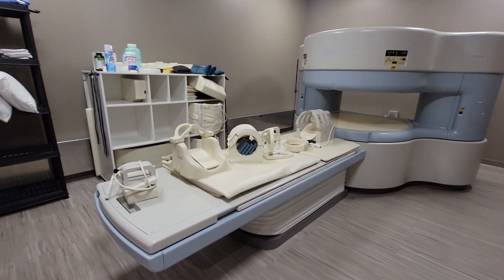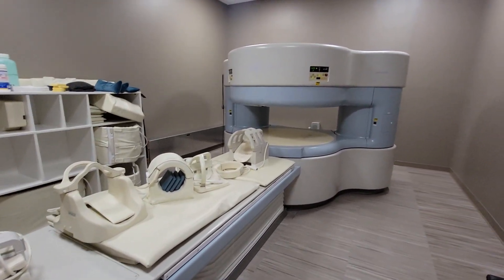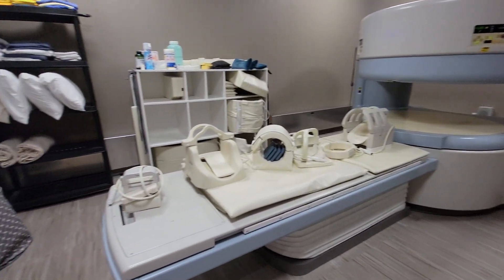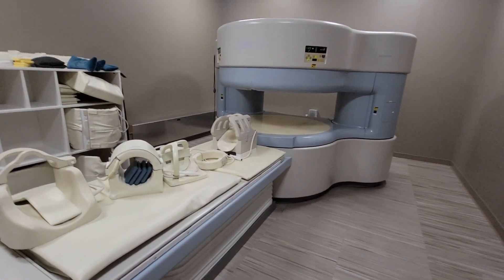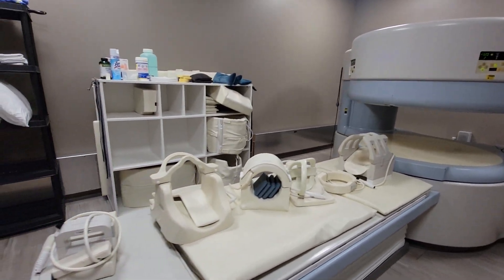Hey guys, my name is Roberto and I'm gonna do a quick overview of the Hitachi Ares Elite 0.3 Open MRI scanner. We're gonna review the coils and some of the tips I have for you if you're scanning on this machine.